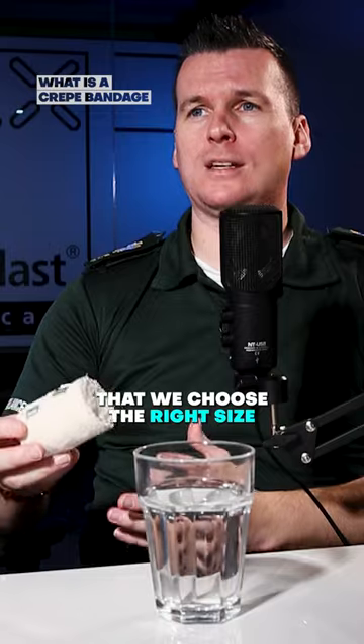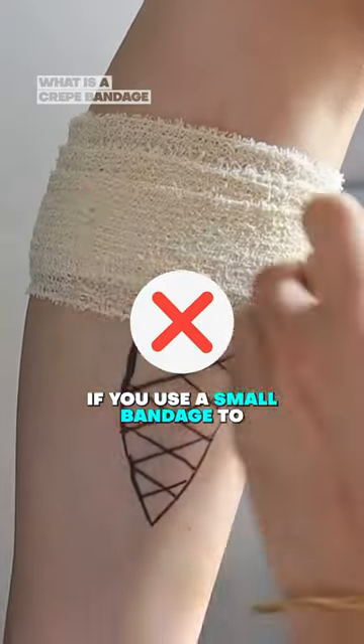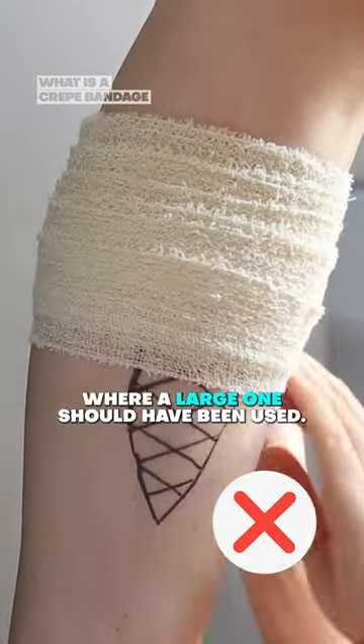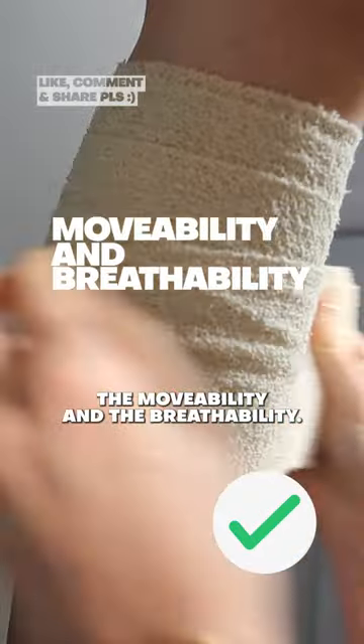It's important that we choose the right size crepe bandage for what it's going to be used for. For example, if you use a small bandage to cover an area where a large one should have been used, this can affect the moveability and the breathability.